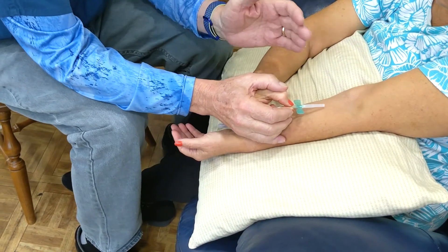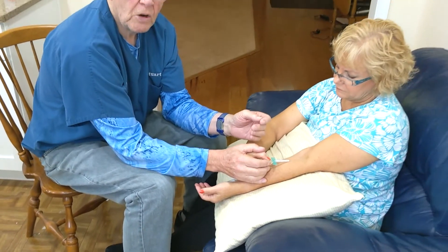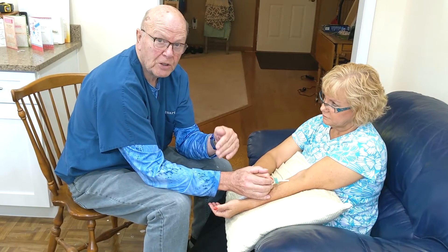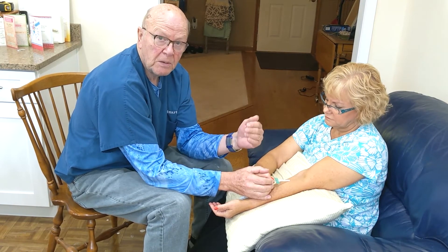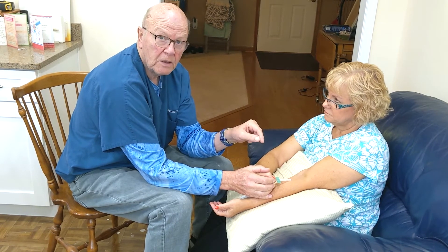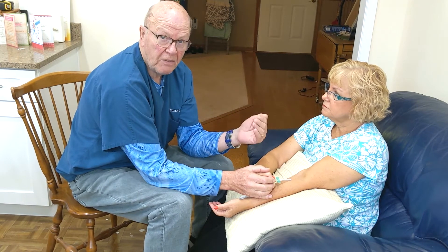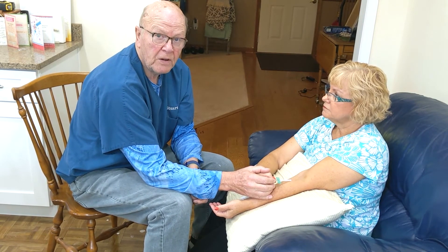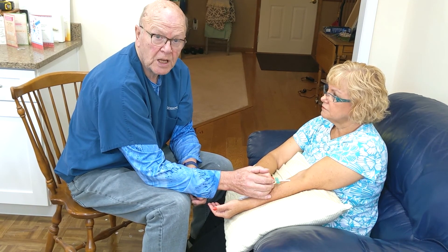What this does is it builds confidence in the patient that they can do this. To go and stick anything in your arm without some assistance is very hard to do. But what you're doing with the tandem part of cannulation gives the patient the confidence that they can do this. After that, they are asked whether they want to continue self-cannulation or want a staff member to help them out. Either way, they have learned a very important lesson in actual cannulation of what takes place during this time period.